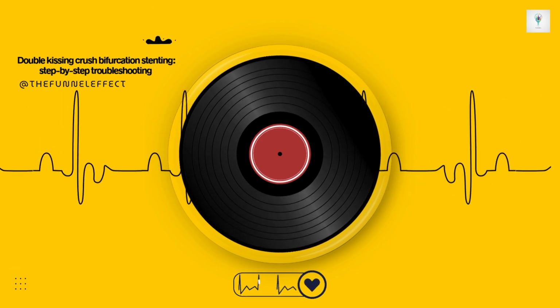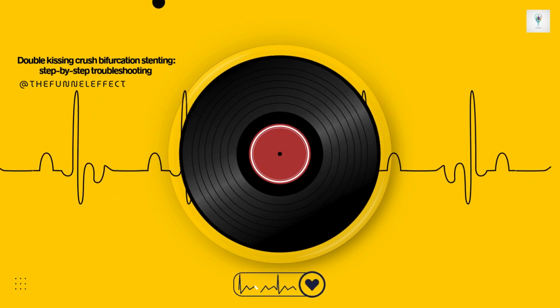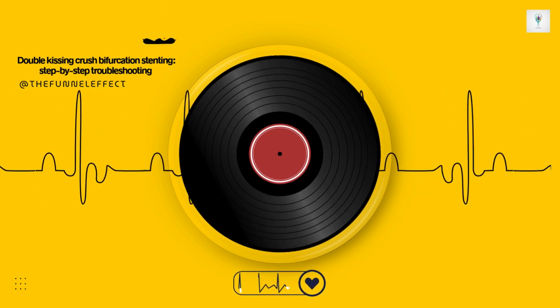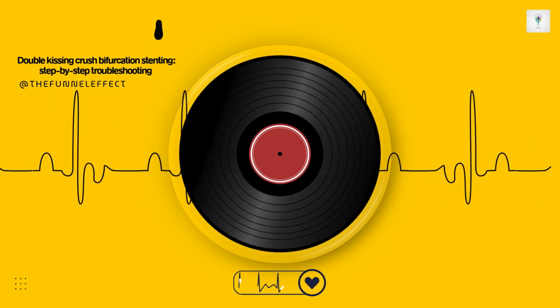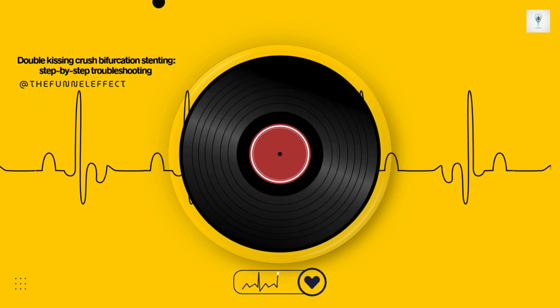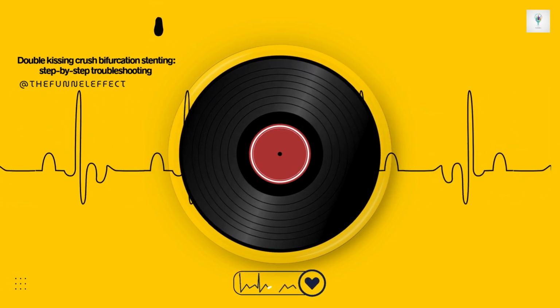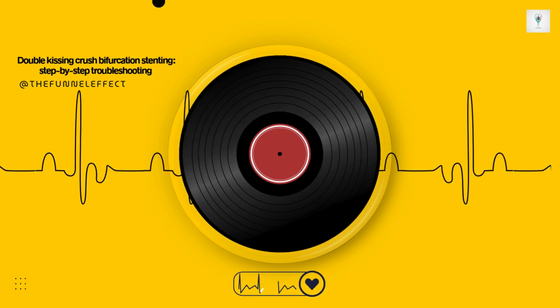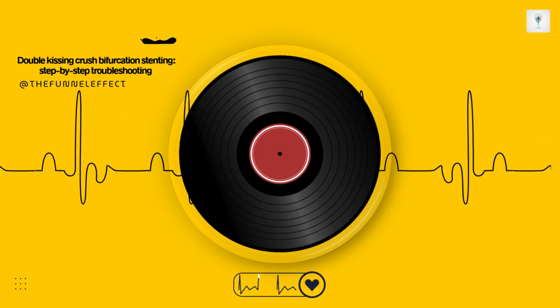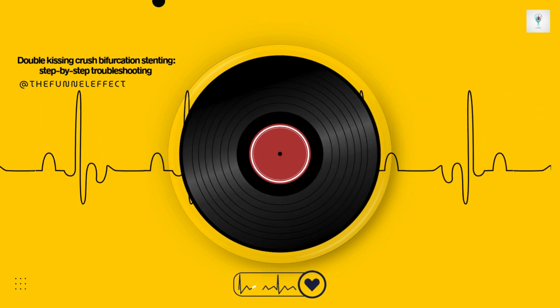It truly is. And I think the main takeaway for you, the listener, isn't just memorizing the 12 steps. It's about understanding the troubleshooting mindset required. The real skill lies in recognizing immediately when something isn't working, stent won't cross, wire won't recross, balloon won't deliver, and knowing which specific tool or technique to grab next. The anchor balloon, the hairpin wire, the specialized microcatheters. Mastering these is what reduces the pain and ensures you achieve that well-documented clinical gain. And that clinical gain, those superior long-term outcomes for these very complex patients, is ultimately why interventionalists invest the time and effort to master this demanding technique.